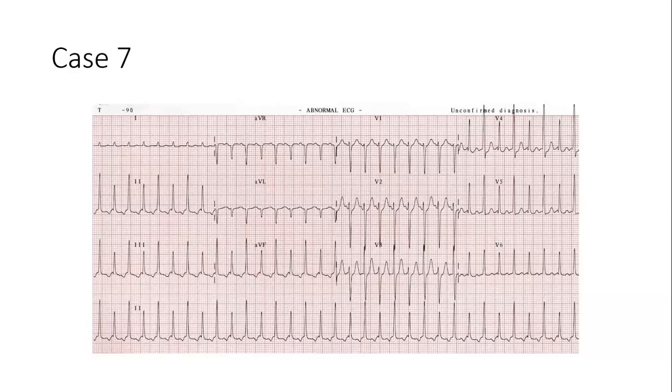Okay. So remember, when you give an electrical shock to the heart, the machine doesn't know what is really happening to the heart. When you do an electrical shock to the heart, whether it's defibrillation or cardioversion, it does one thing: it depolarizes the myocardium.